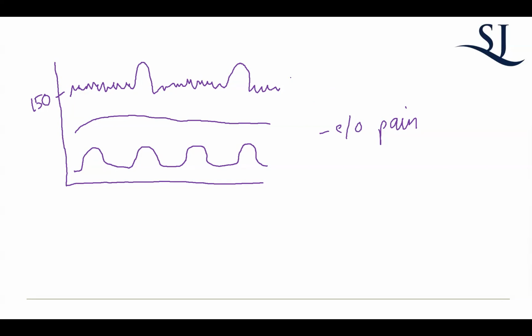Because there is 2 accelerations within, I don't know the actual period. I think maybe 20 minutes, like you said. Yeah, this is. 1 second. Sorry about that. So now remember that for NSTs, you need your accelerations, but to be a category 1 tracing, what do you need? Because she's in labor, right? So now it's a category. Having accelerations is good, but you don't need them. But what you do have is moderate variability and no decelerations. So yeah, it is good. It's reassuring. It's category 1.